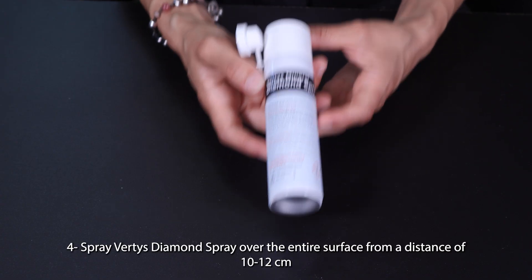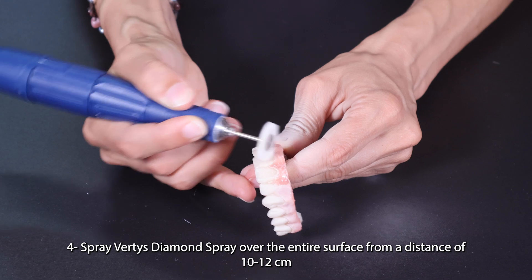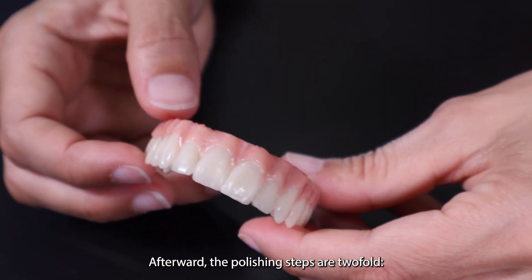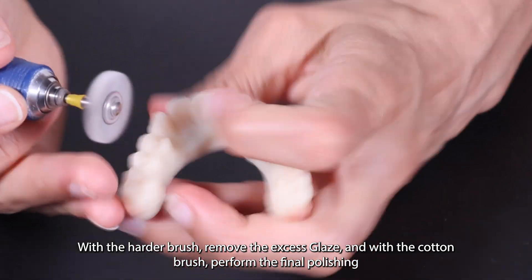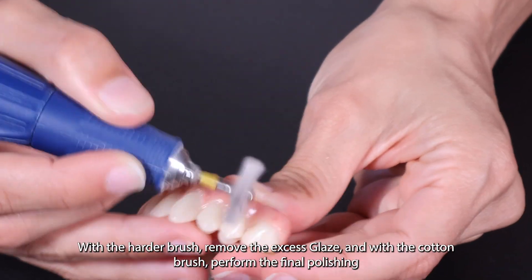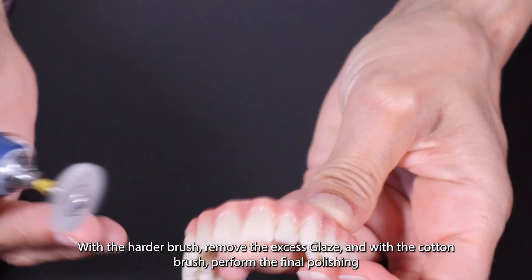Four, spray Vertis Diamond Spray over the entire surface from a distance of 10 to 12 centimeters. Afterward, the polishing steps are twofold: with a harder brush remove the excess glaze, and with the cotton brush perform the final polish.